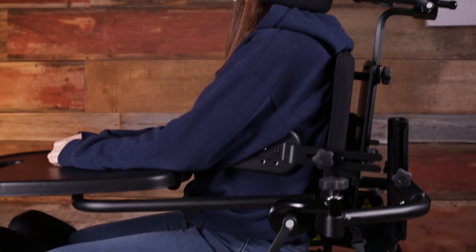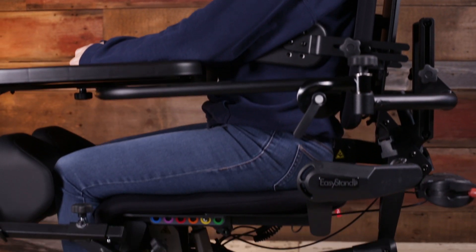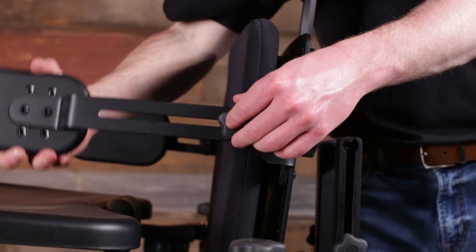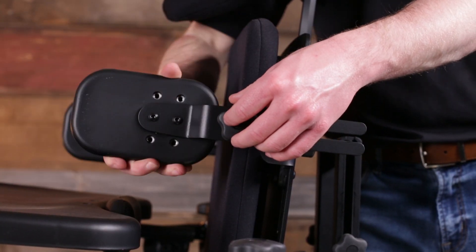Seating is available in planar style with optional hip guides and laterals. It is also available in a contoured form-to-fit style with built-in adjustable lateral support.